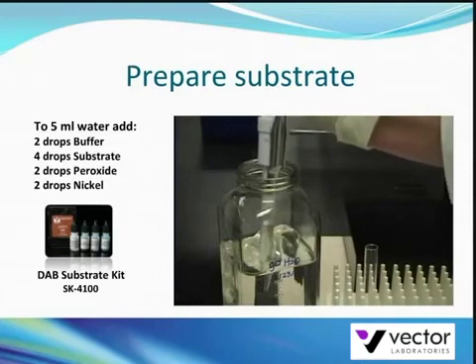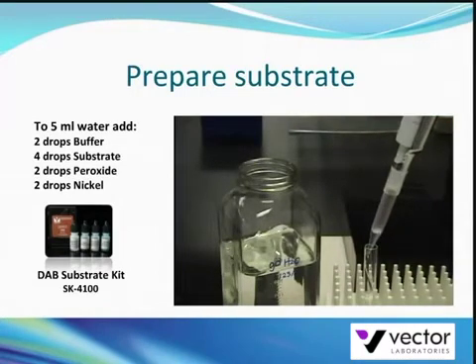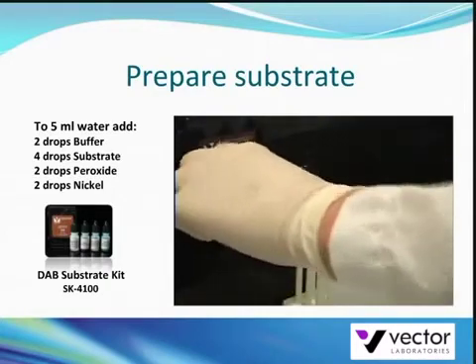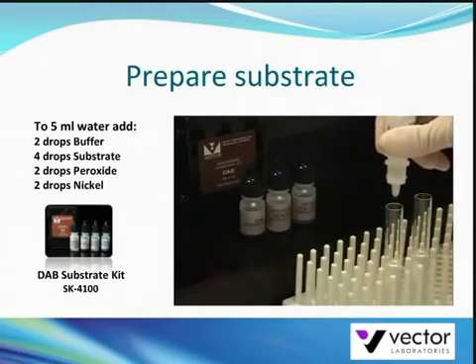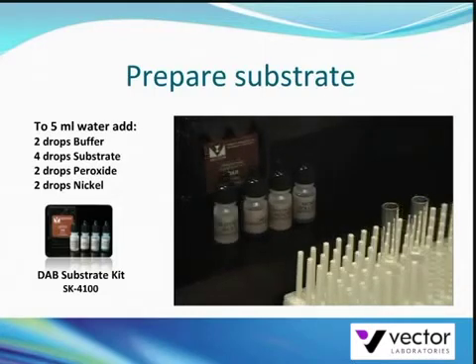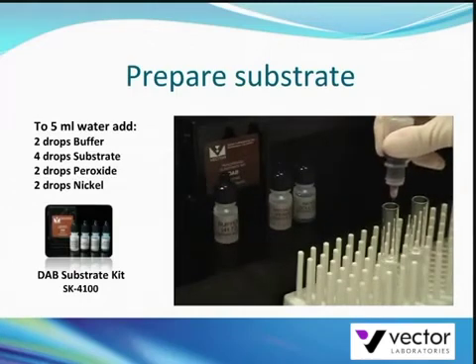Prepare the DAB substrate solution immediately before use. Put 5 ml of distilled water in a glass test tube. Add 2 drops of the buffer stock solution. Then add 4 drops of the DAB stock solution and mix well.